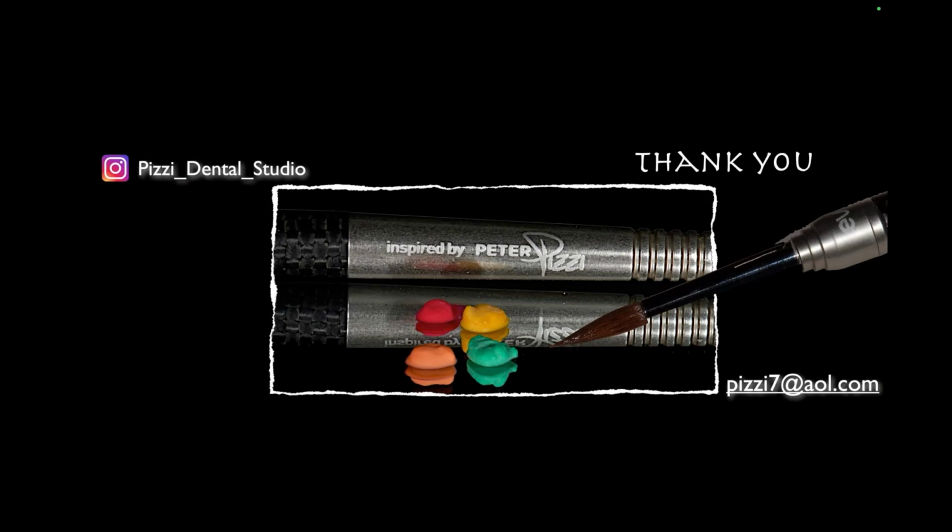Probably zirconia is second option for me because, again, I could get 4 or 5/10 of a millimeter, and I could change the coloration of the zirconia. Lithium disilicate, I don't want to say it's my least favorite. I think I kind of go to that third, although I have two big lithium disilicate cases on my desk right now, and those are chosen for the right reason, meaning that maybe it's a veneer case where I want lithium disilicate on the edge, but I still have the ability to do some layering.